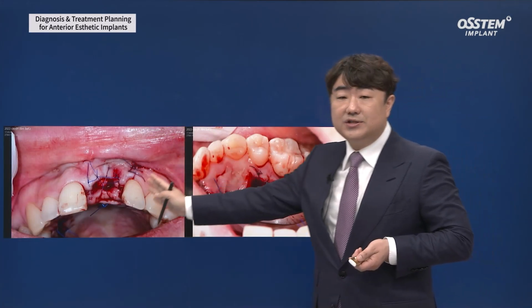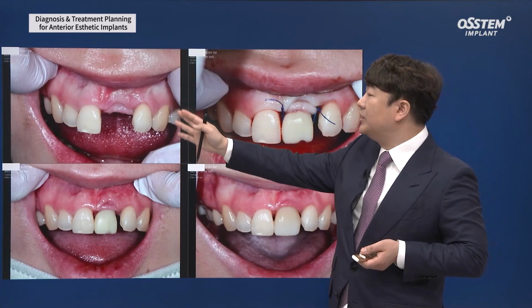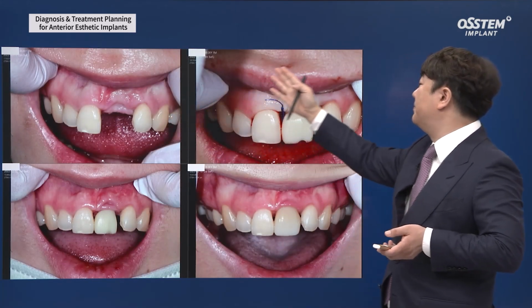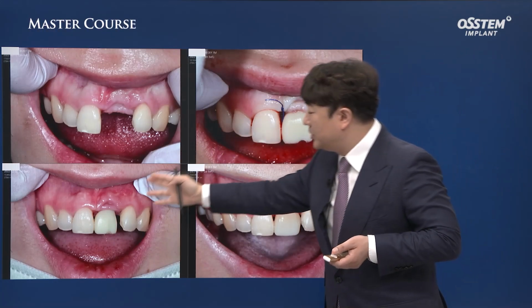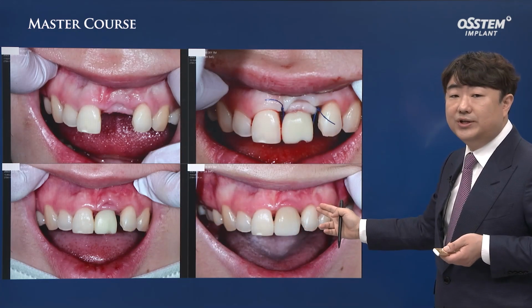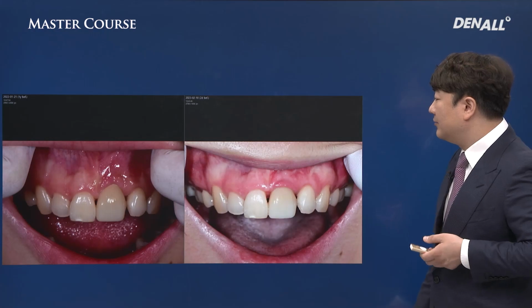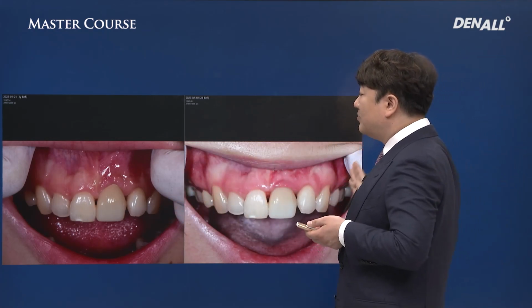Soft tissue grafting was done. The prosthesis was removed, the soft tissue grafting was done, and healing took 2 months. It was quite hasty, but 2 months later a provisional was provided, and after a 2-month healing period, the final prosthesis was delivered 6 months post CTG.